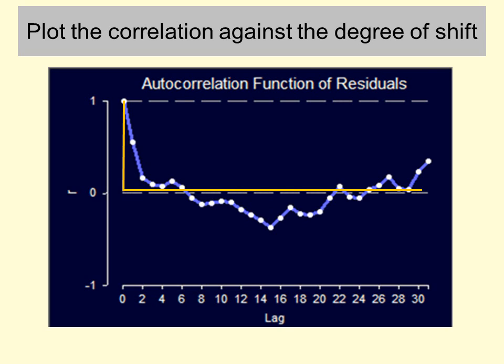So that orange line was just to indicate what it would look like if the temporal structure of the noise in fMRI data was white, i.e. there was no structure in it, it was random, which is what the statistics want to assume. The autocorrelation structure would be such that there'd be a perfect correlation at lag 0 and then 0 correlation at other lags. And that just highlights the two problematic lags.